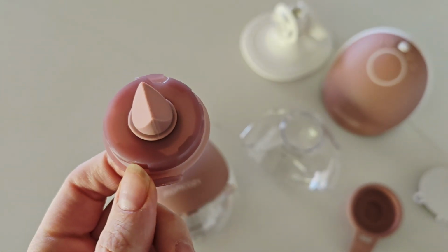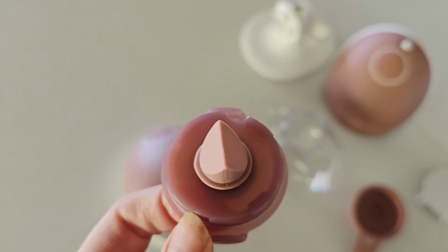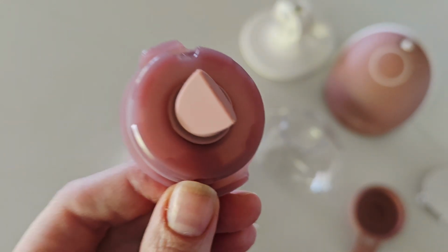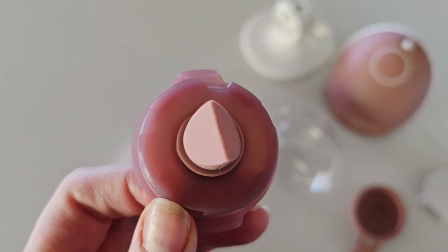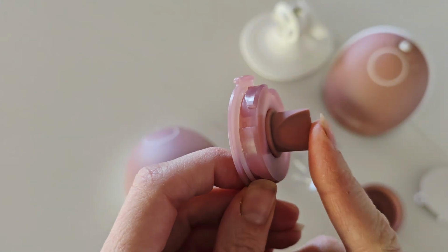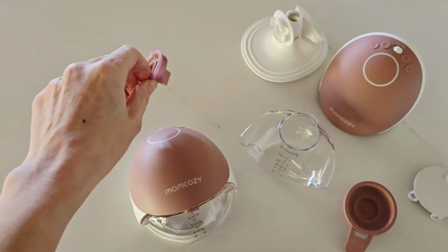So that is a simple, depending on your use, 1 to 3 months. So if you are an exclusive pumper, you'll be needing to replace this probably monthly. If you are somebody that's only an occasional pumper, you'll probably get 3 months out of it. So this one is generally a cause of loss of suction.